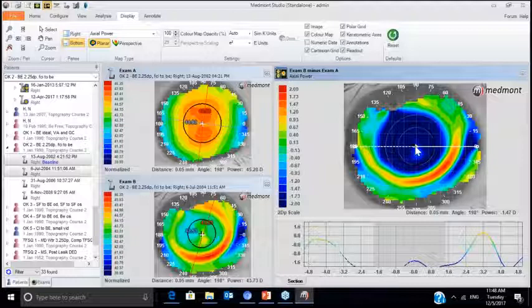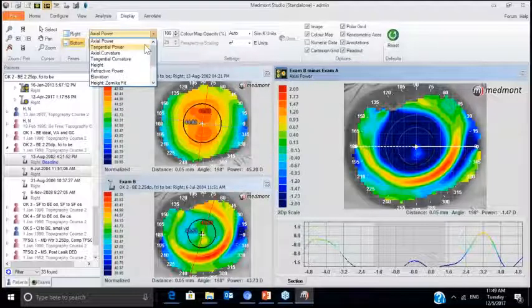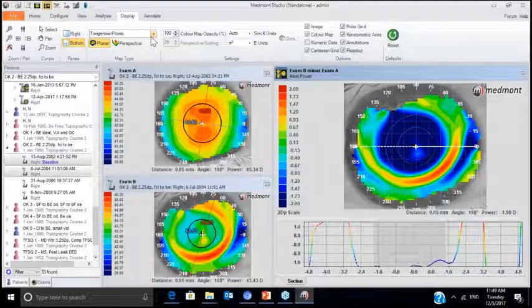And ortho-K should work in the reverse. There should be the most effect in the center and the least effect in the periphery. But this is only one night of treatment. And as Nikki will tell you, ortho-K takes 7 to 10 days for full effect. So we need to wait this out and see what happens after the lens has its chance to create full treatment.